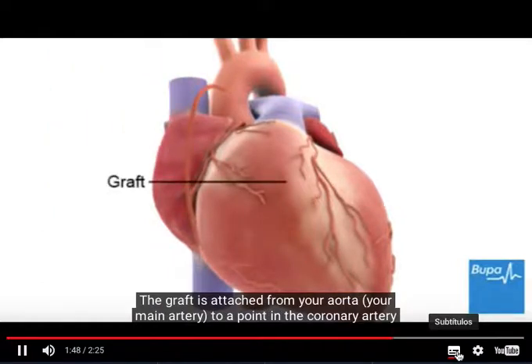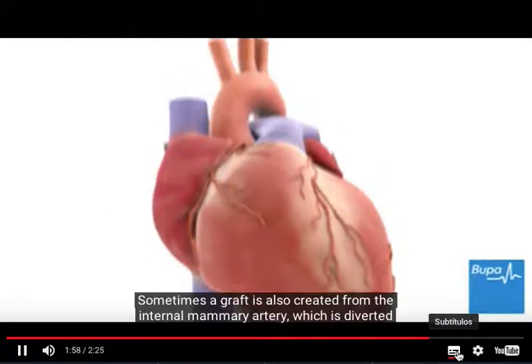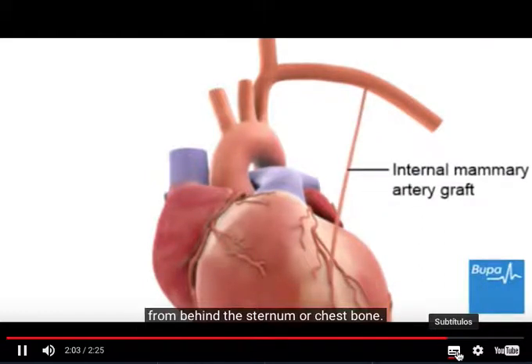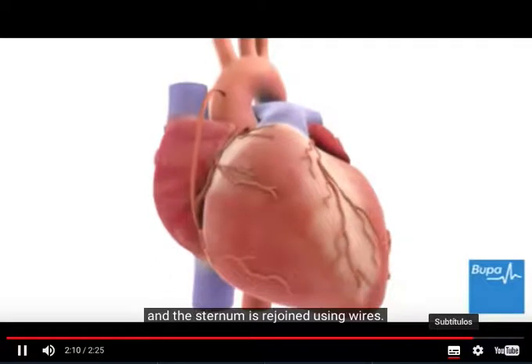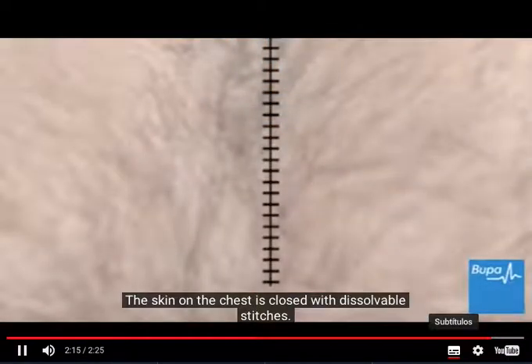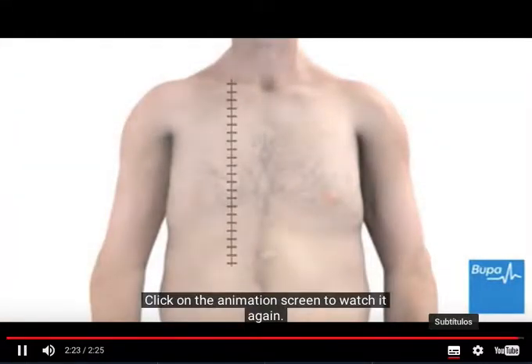The graft is attached from your aorta, your main artery, to a point in the coronary artery beyond the blockage. Sometimes a graft is also created from the internal mammary artery, which is diverted from behind the sternum, or chest bone. After the graft is attached, the heart is restarted with controlled electrical shocks and the sternum is rejoined using wires. The skin on the chest is closed with dissolvable stitches. This is the end of the animation. Click on the animation screen to watch it again.